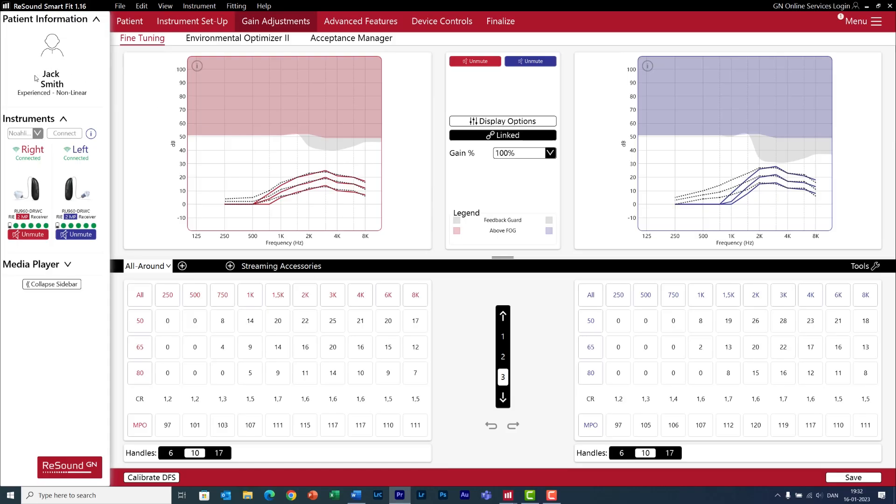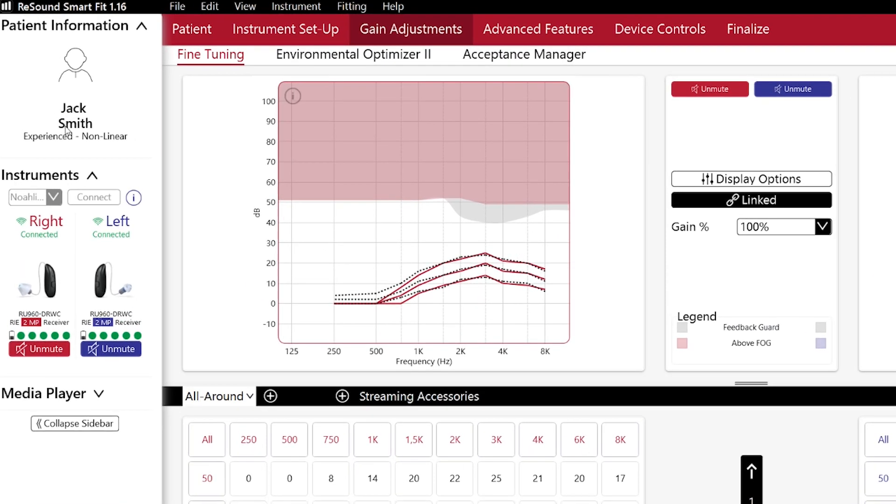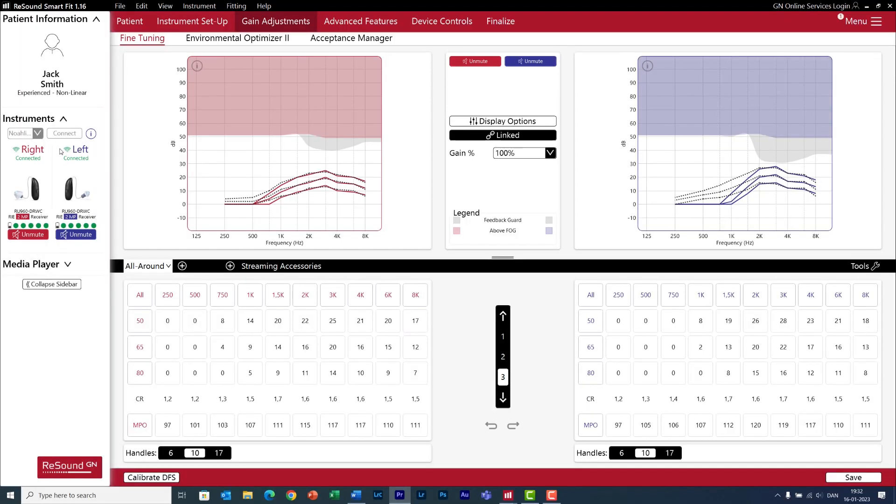On the sidebar you have information about your client and the status of the hearing aids. In this way you can easily check how much battery the hearing aids have - right now they are fully charged - and whether the hearing aids are connected to the software, which is shown with this green icon.